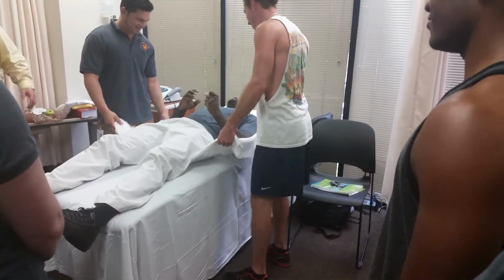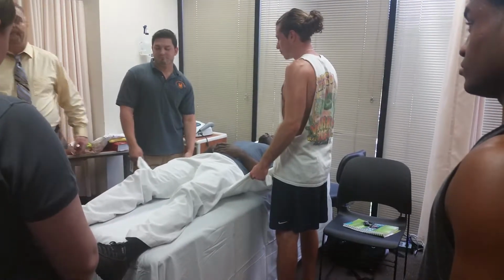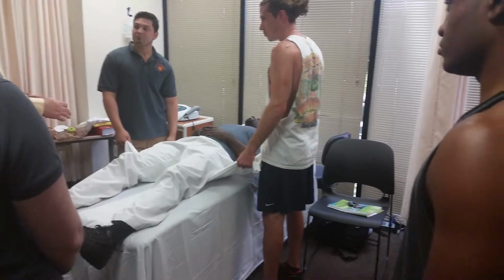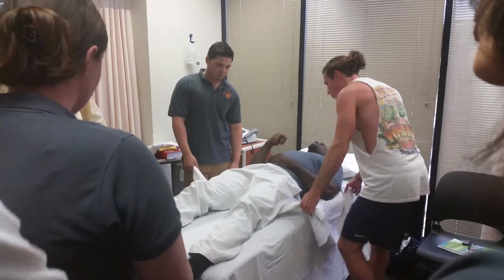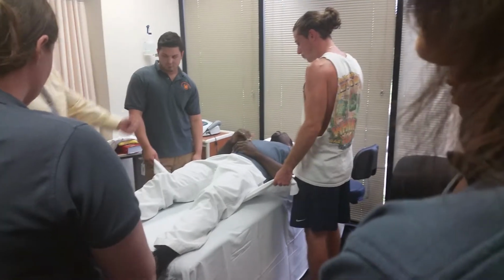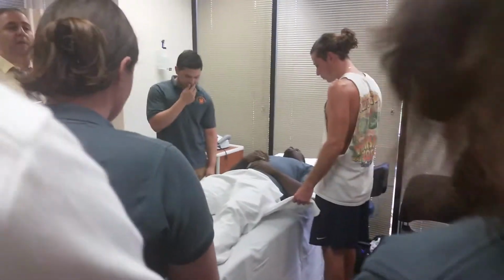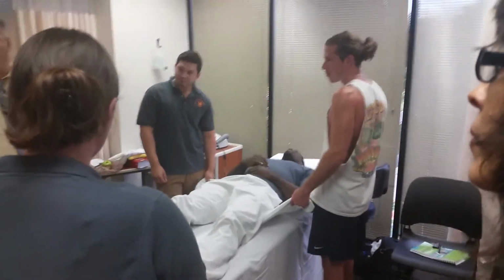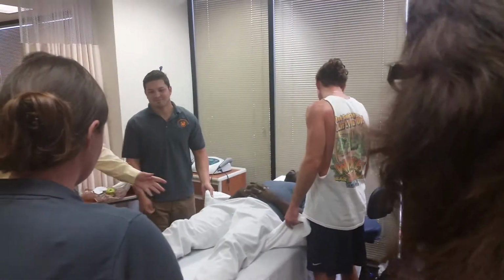And so the components are what? What do you have to avoid? You have to avoid twisting. So what position is Gabe's left foot going to be in? He has to be pointed that way, so he's going in that direction. Same thing with Sean on the other side. Who's going to lift more, Gabe or Sean? Same. The idea is they lift the same.